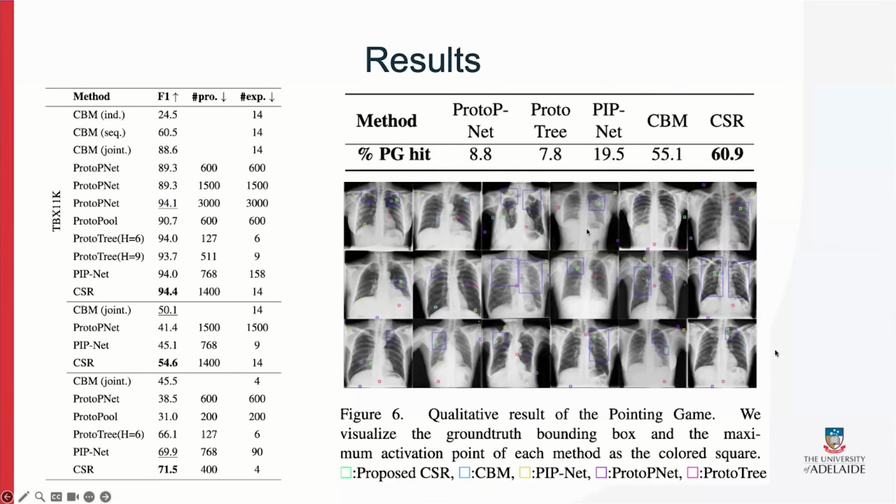Yeah. So CSR achieved this result without intervention of the doctor. And in the paper, we also show that the intervention of the doctor greatly benefits the performance of the model, where the concept interaction is more impactful than the spatial interaction. But the spatial interaction will still also yield very beneficial results. After this, I will show you the demo of CSR.